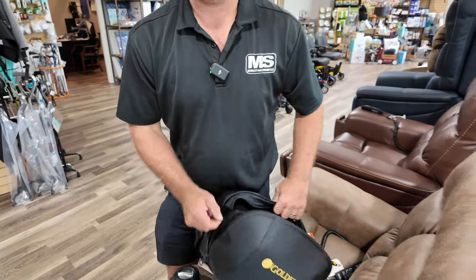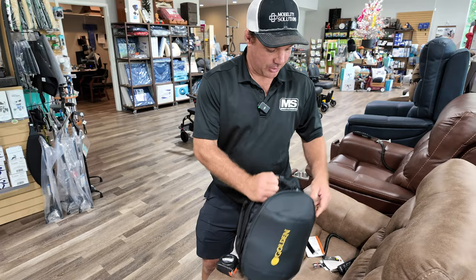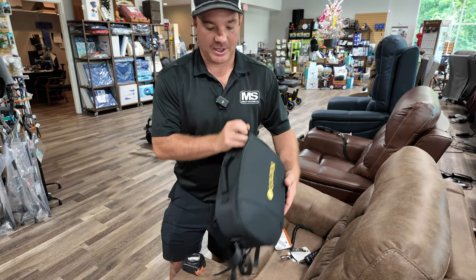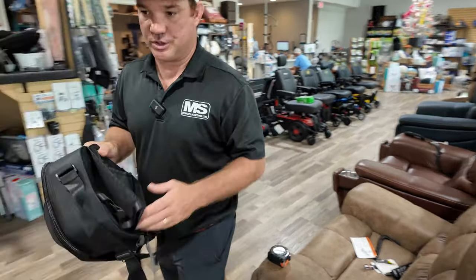This fits perfect on our GB120 fold-up scooter. It also can fit on other units — it doesn't have to be a Golden product. Even though this says Golden, it doesn't have to be a Golden product.